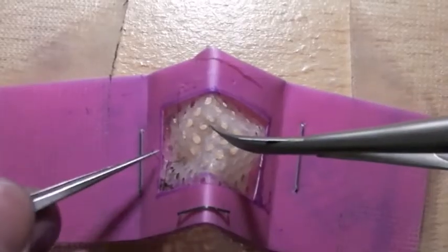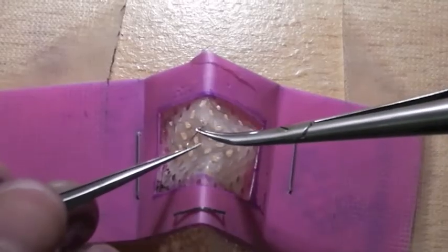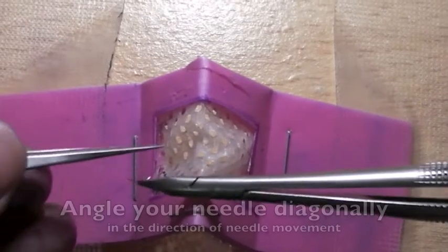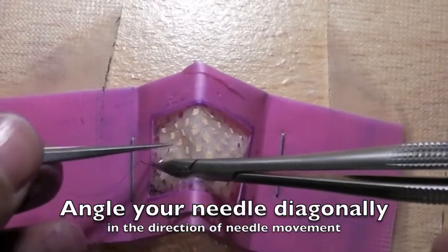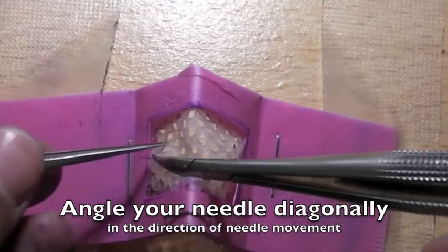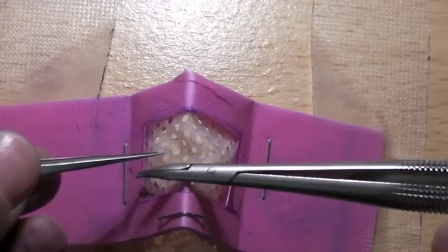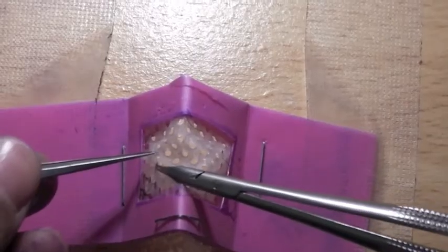Once you've reached the end, go backhand from left to right. Reposition your needle and go backhand right from the edge of your visual field on your microscope. Going backhand is far more tricky because you're going backhand and diagonally — have patience, you will get there in the end.